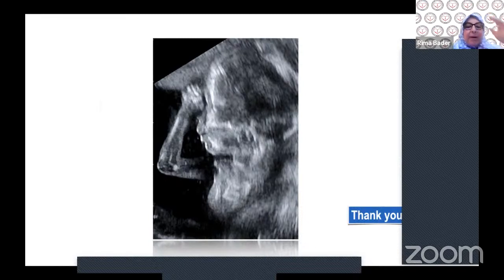We have two questions, but also since we're talking about the basics, I was just wondering about the tricks that you use. I've attended your sessions a lot. You have summarized that you wanted to make sure of the 4 or 5 aspects when everyone is adjusting the image. So the color is important, the frequency is important, the transducer is important, but which is the most important one? To me, at least, proper 2D is the most important before we go into color and Doppler. Do you agree to that?